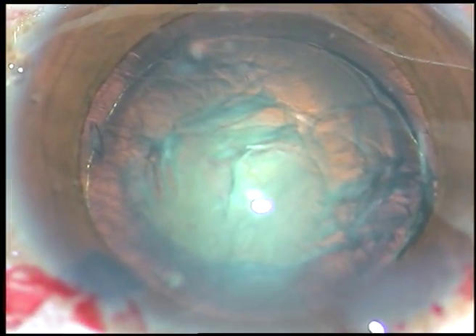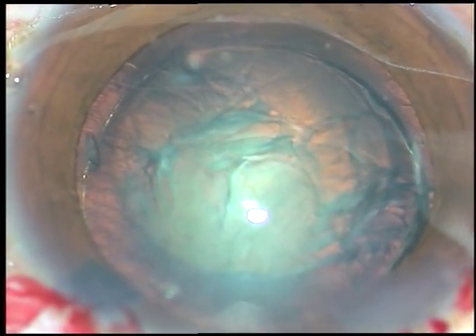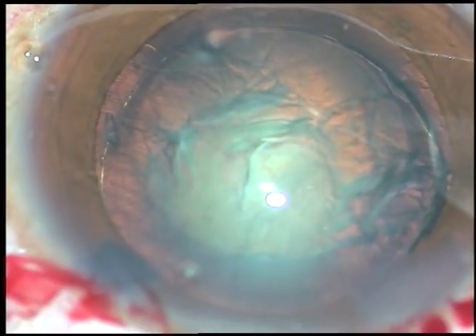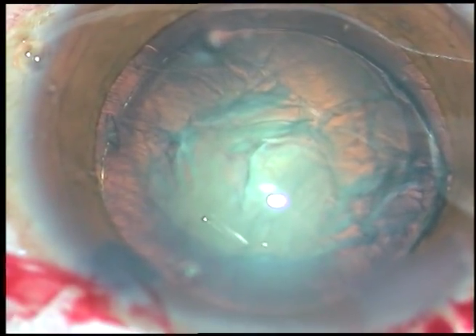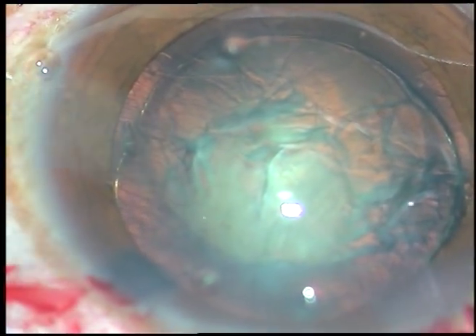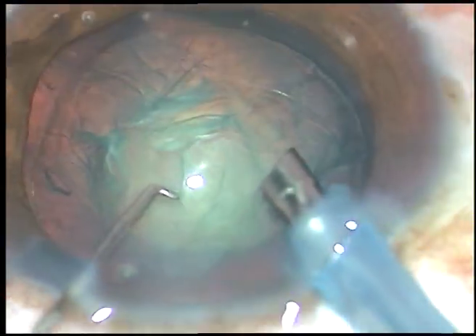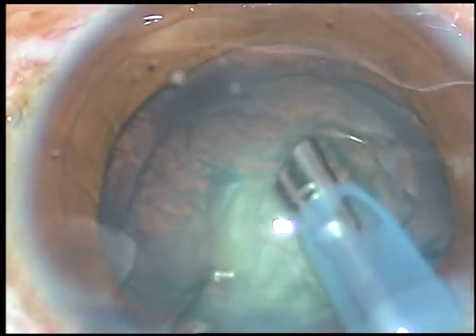Viscoelastic substance is injected again and now is the time to introduce the tip of the FACO handpiece. The machine being used is the Oertly Catarix III FACO machine. It is a beautiful machine — no financial interest — but if you use this machine you will love this machine.